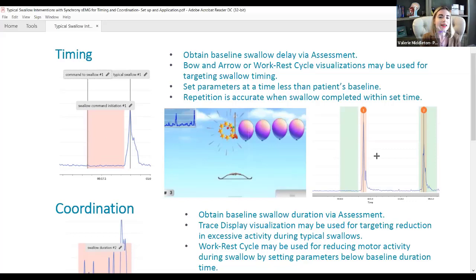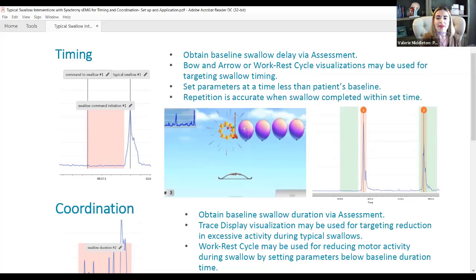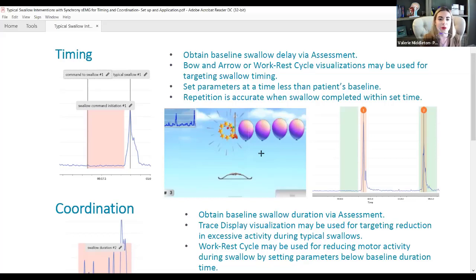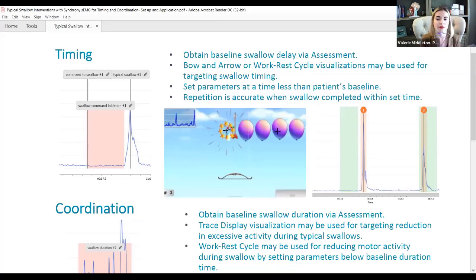We have a couple of applications within Synchrony to address timing. One visualization is our bow and arrow exercise, where the patient's swallow is represented by an arrow. When the patient swallows, the arrow is released from the bow, and the goal is to pop the very first balloon. We also have resultant balloons the patient can hit if they're a second or two late, providing a range. This feedback is available immediately and objectively for your documentation.